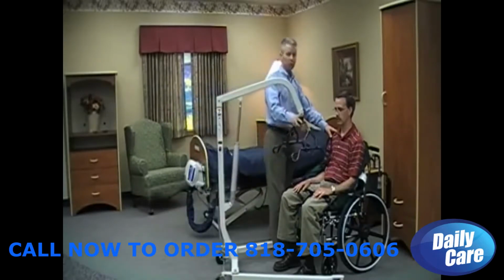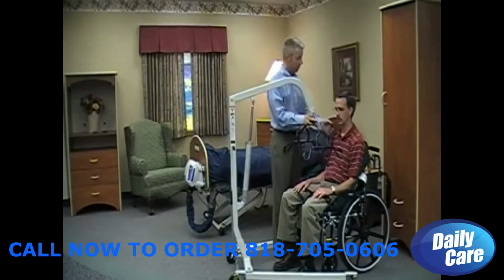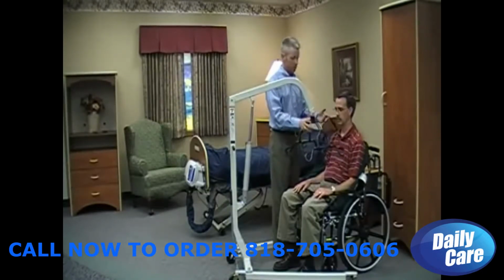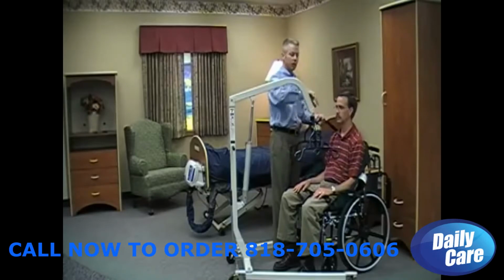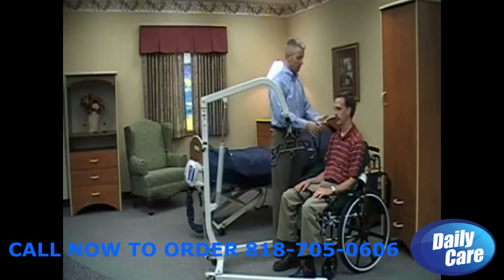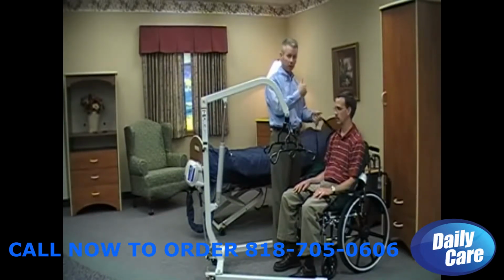And again, we want to ensure the cradle's at about chest height. From here, once we bring it up, we want to make connections with the shoulder straps first and then with the leg straps. And you'll see that there are two different lengths of shoulder strap. If we use the shorter length, we'll have the resident or patient in a better sitting position. If we use the longer strap, we'll have the resident or patient in more of a reclined position. In this instance, if we were transferring from a chair to a bed, we'd want them reclined so we can line them up in the bed more appropriately.